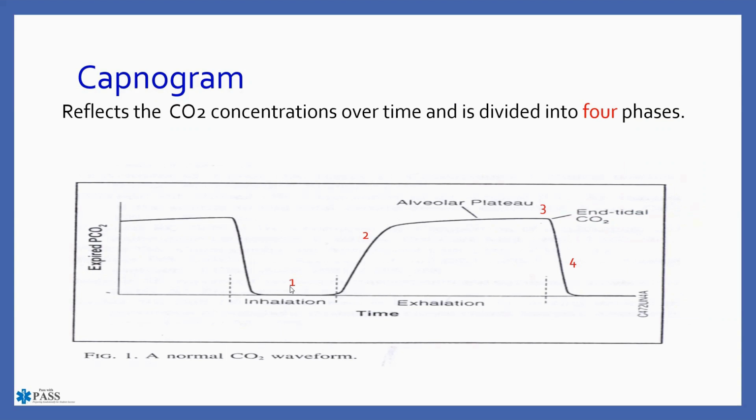The first 3, 1, 2, and 3, are looking at exhalation. And then phase 4 is looking at inhalation, getting back down to the respiratory baseline. And this will make more sense to you here in just a few minutes if you're not already aware of what's going on.